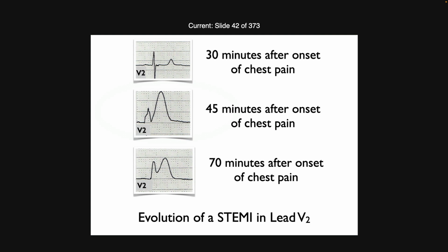I know with at least the LifePaks, they will automatically spit out 12 leads when there are ST elevation changes or if the rhythm changes. That's great, but I would not rely on that, because it just prints out and you think, I should probably pay attention to it. Thank you for mentioning it, but I doubt very much it's going to pick up the T-wave changes. More comments, questions?